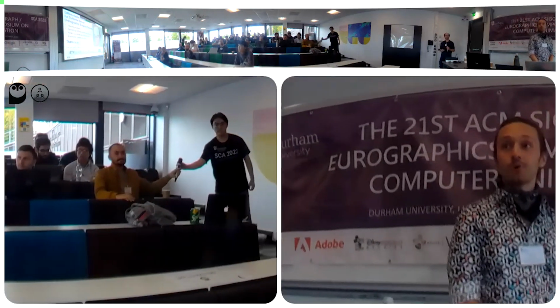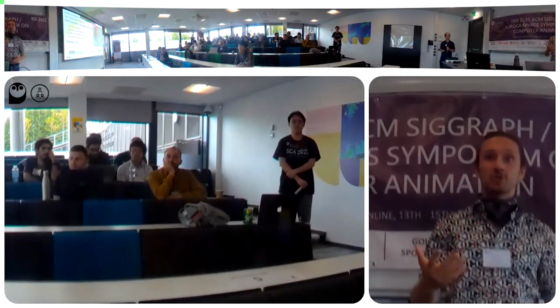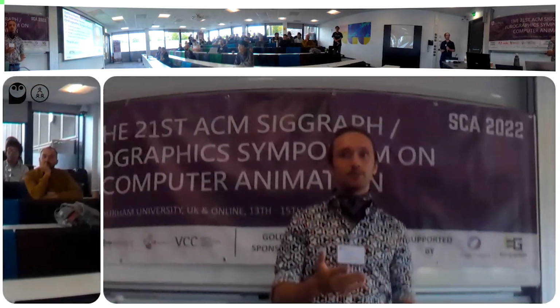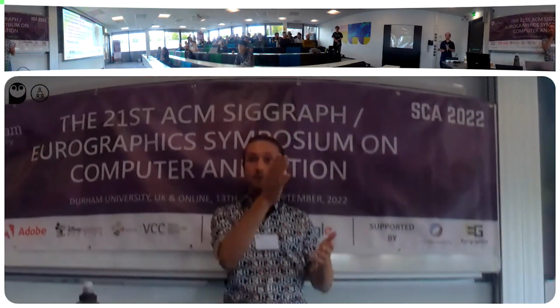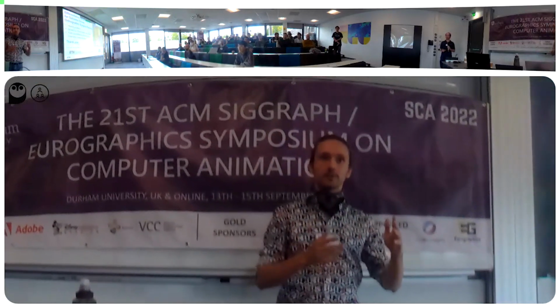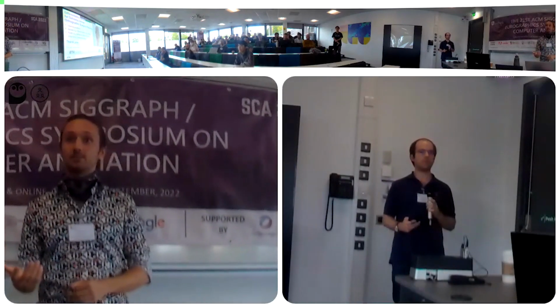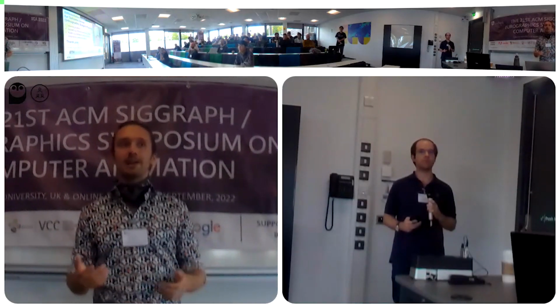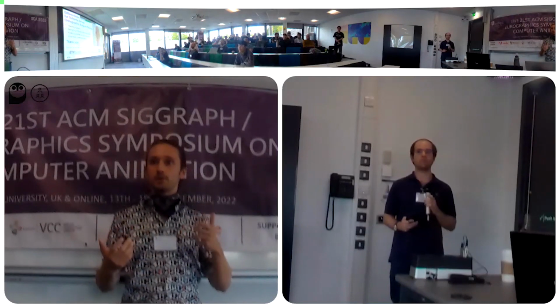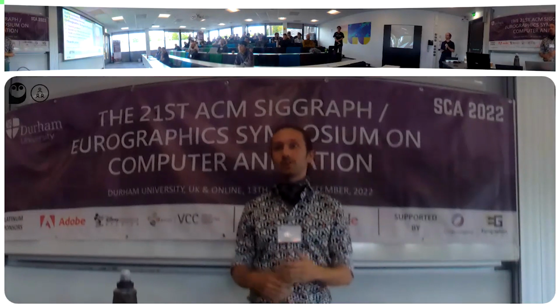So that is a challenging problem. Currently what's done is that the doctor identifies those structures in the medical images, so the CT scans, and then there are surgical techniques that are designed to avoid damaging those structures, specific shapes of the cuts. And in order to automate that, we would need to be able to segment those structures, identify where they are, and then parametrize the surgical plans in such a way that they're able to place the cuts and not intersect or damage those structures.